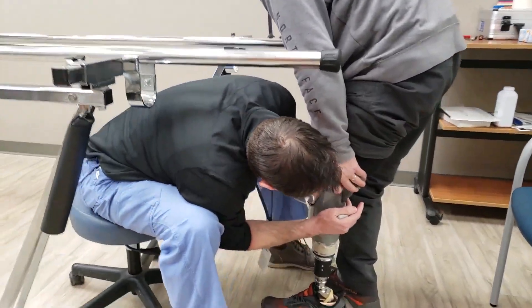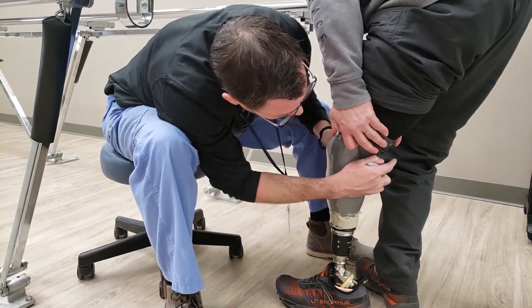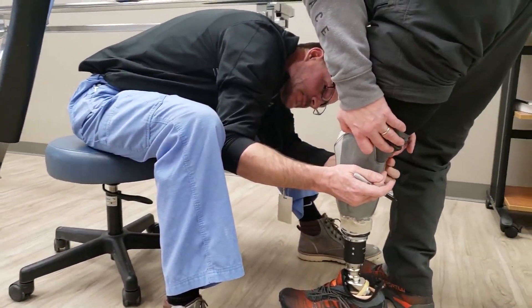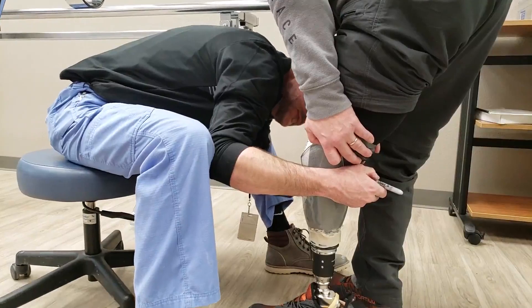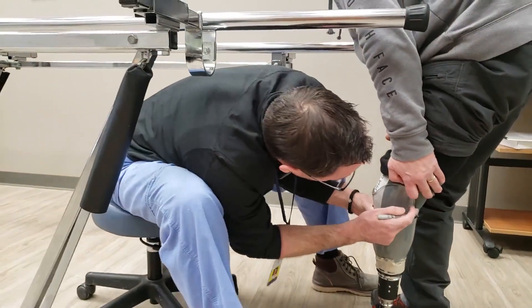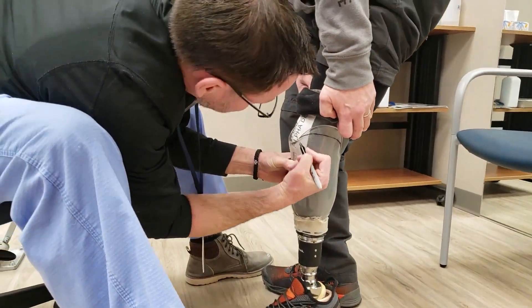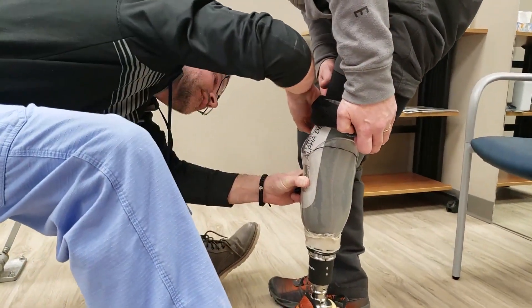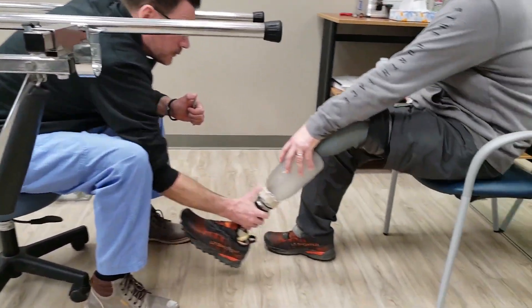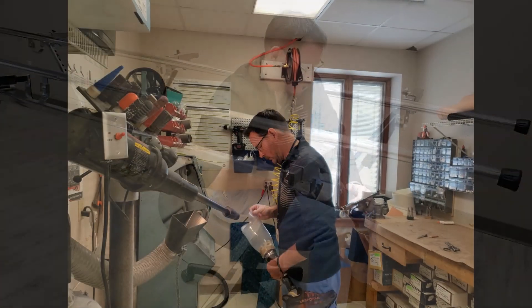While engaging the patient on what they feel and the sensation they're getting from the prosthesis, the prosthetist and patient work to make minor adjustments to the test socket to maximize function, fit, and comfort. Once areas needing additional attention are marked, the prosthetist returns to the lab to make minor adjustments before any significant ambulation or gait evaluation is performed.